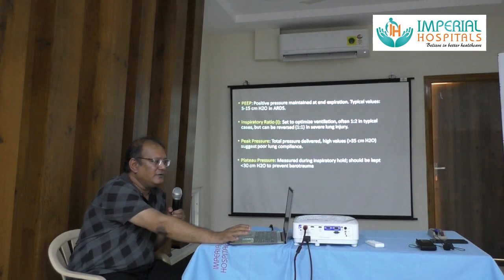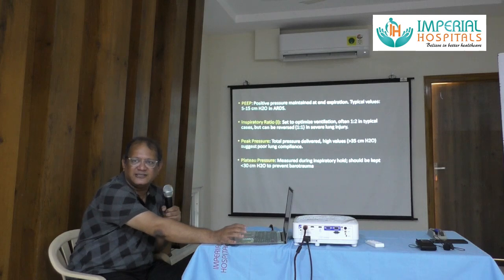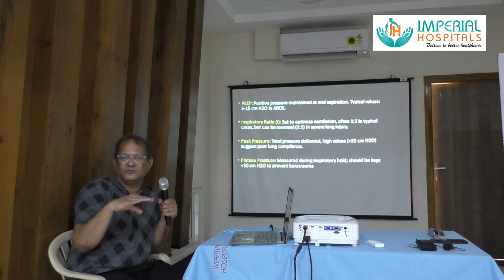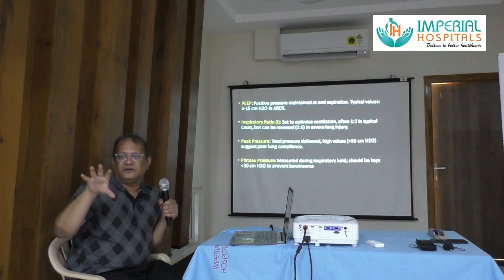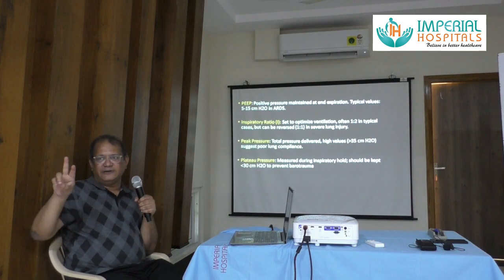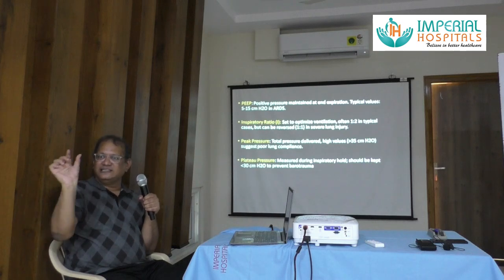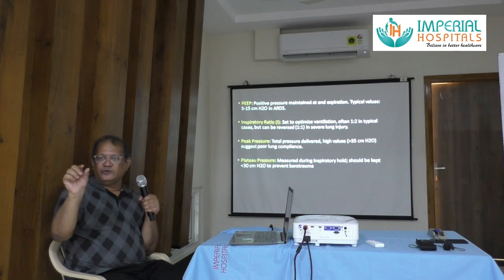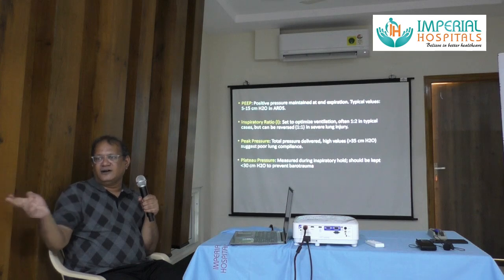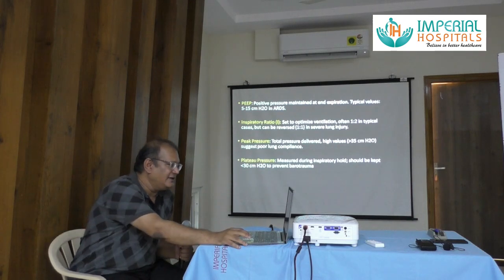In cases where you want to recruit patients or if there is V/Q mismatch, you want to have a higher I ratio compared to the E ratio, right? So you want higher inspiratory time, because the inspiratory part is of two types. One is where the flow is there, so you are delivering the air, and then the inspiratory pause, where the delivered air stays in the lungs. So if you increase the inspiratory pause time, there will be more time for diffusion across the alveolar-arterial membranes, right?